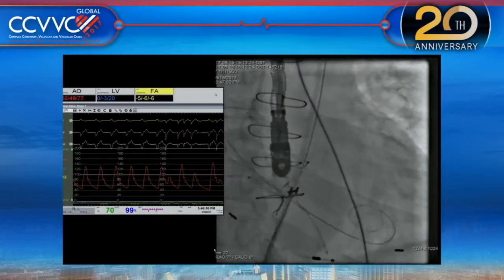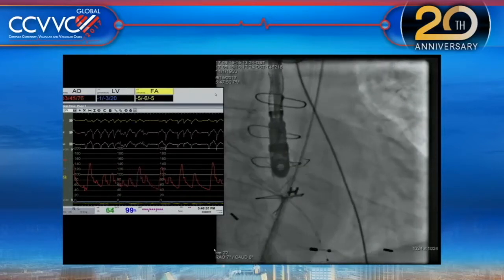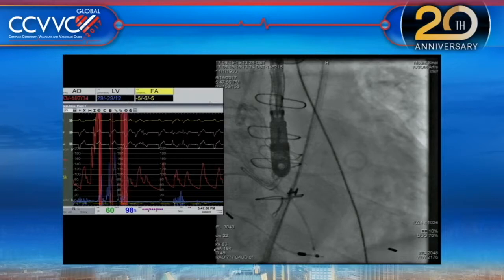Yeah, I mean, obviously, I think we're not exactly at zero there. We're at like -3, I would say, or -2, which I think is okay. Let's look at the hemodynamics. I think you got to leave like 0.5, not exact 0. You cannot just do 0. That's close. I would also be very uncomfortable with a 0.